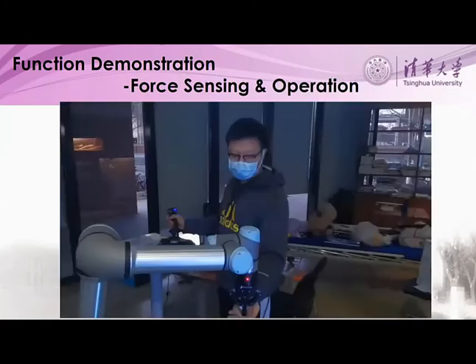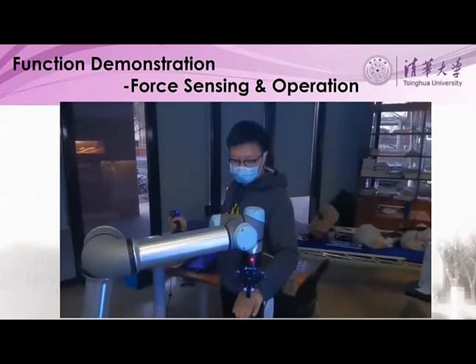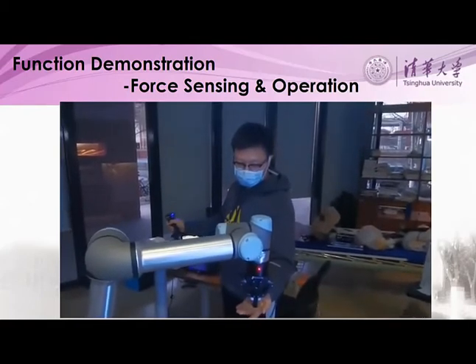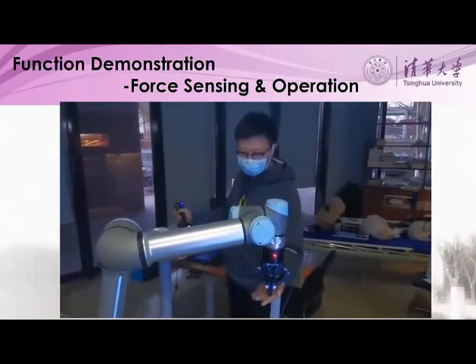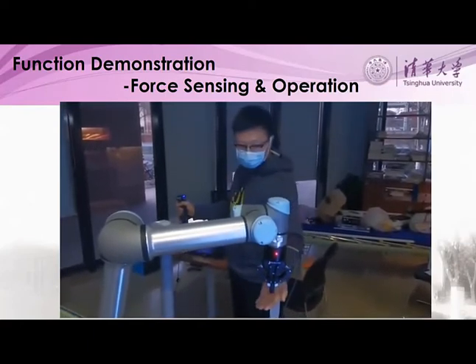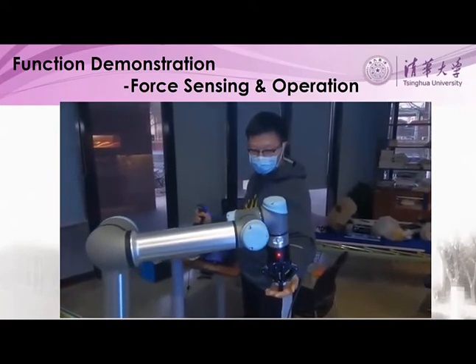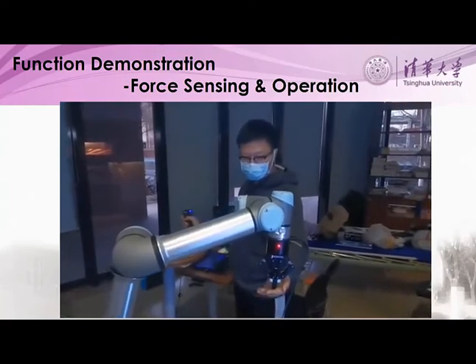Finally, force sensing and teleoperation through the joystick are demonstrated to show precise remote human control. Now we're adding the force feedback and testing the translational movement of the robotic arm — see how it follows the movement of the hand. Now we change the mode and test the gimbaling of the robotic arm. Notice how the arm moves with the joystick input.